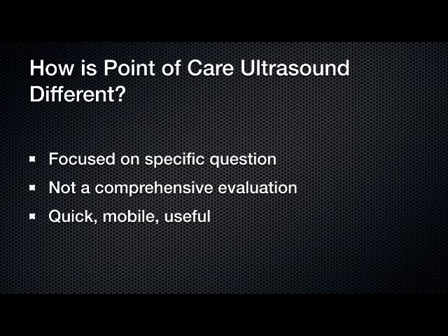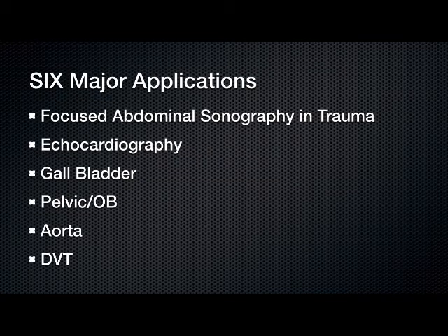So when it comes to actually using ultrasound in the emergency department, it's a little bit different from radiology ultrasound, because radiology ultrasound is designed to look at a comprehensive sort of assessment of a particular body part. Now for us, we're really trying to answer very specific questions. So the 6 major areas that we normally focus on are these listed here, and I'm going to go into a little bit more about each of them.